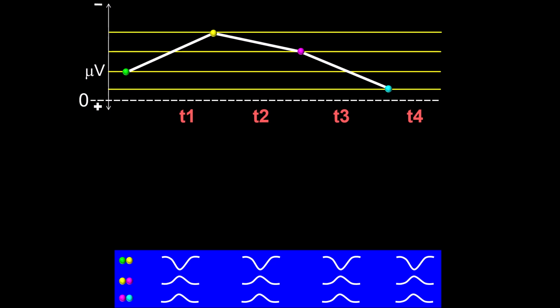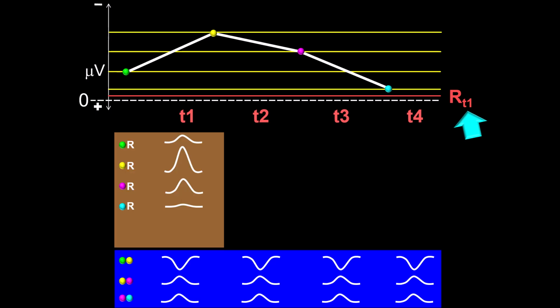Now, were we to change the montage to a common electrode reference montage and assume that the potential captured during this recording is the same as the potentials captured during the bipolar montage, we will see something quite different. The tracing collected in such circumstances will, unlike the bipolar recording, change over time. Let us imagine that the value of the reference electrode at time 1 is close to the zero line, representing minimal negativity in the field. We would get no phase reversal in such a condition.